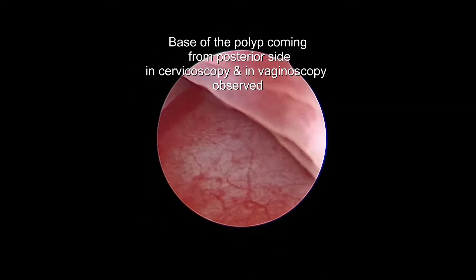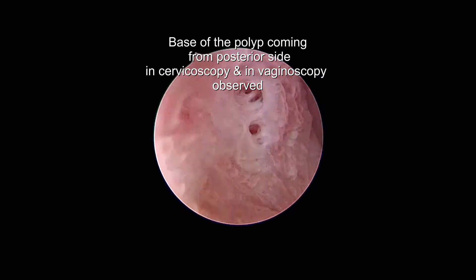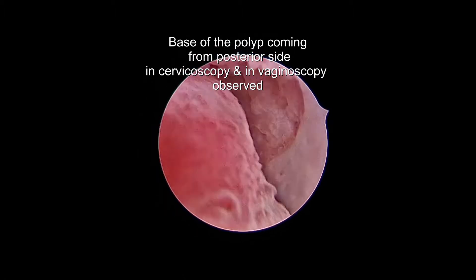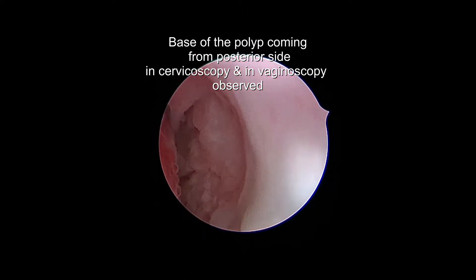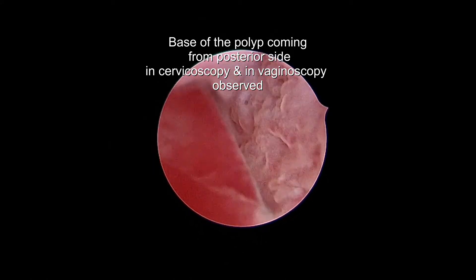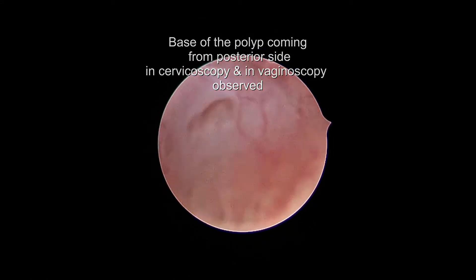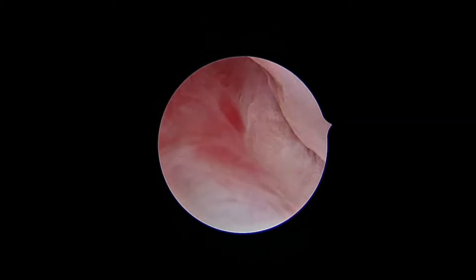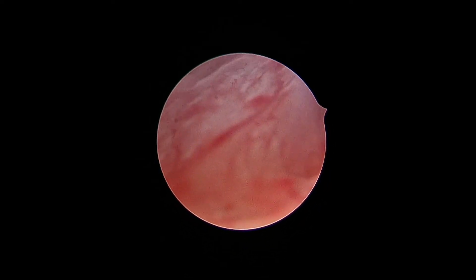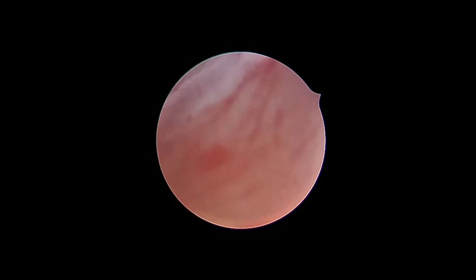Gradually I am finding out the canal through which I can enter inside. I am trying to see the extension of this polyp — from where it is, from the lateral to the posterior side. You can see the marker here, which means the polyp is coming from the posterior side.